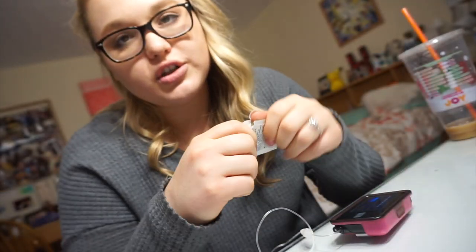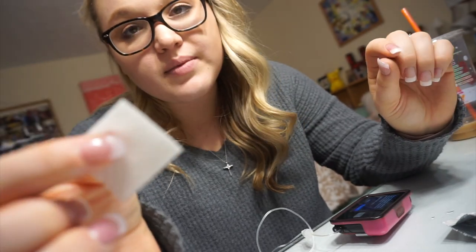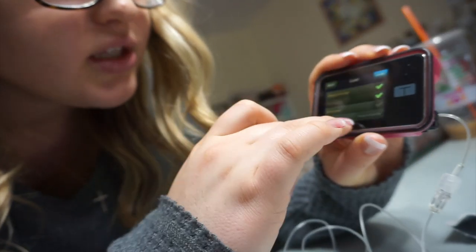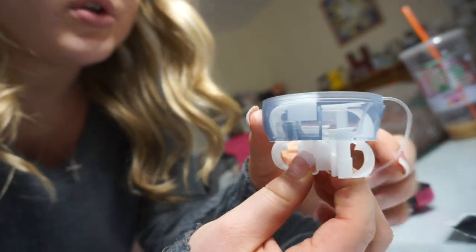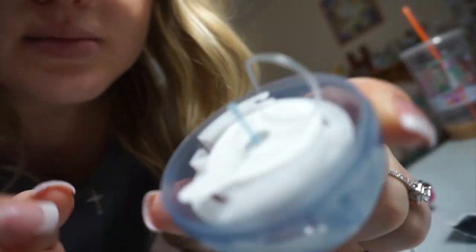Now it is filled and detecting the insulin. While that is occurring, I take out the prep pad and clean off the surface of my skin where I'm going to put the new site. I rotate it — I have it on my backside, so whenever it's been on one side for the last few days, I switch to the other side. Now that I've cleaned off the surface, I have to wait for it to dry and follow the rest of the prompts. It says done, so the only thing left is to fill the very end of the needle once it's on the body.